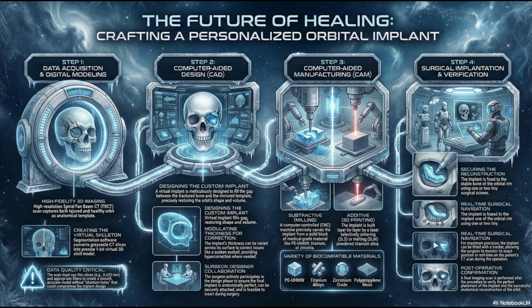It really has. I mean, the shift away from a surgeon just manually bending a piece of titanium mesh in the operating room to creating these perfectly precise patient-specific implants, it's probably the single biggest leap forward in modern maxillofacial surgery. It demands an incredible level of precision.